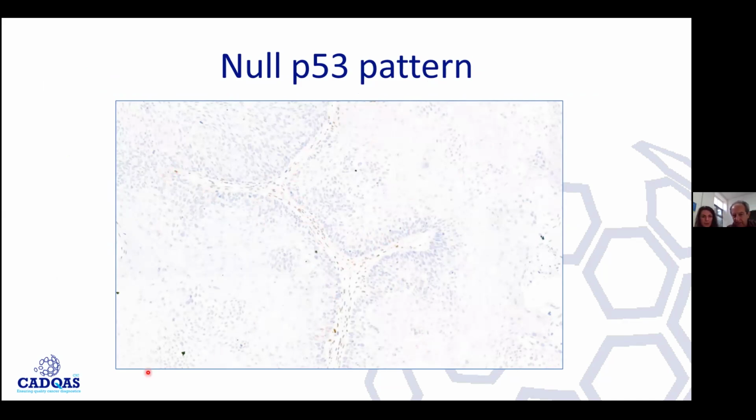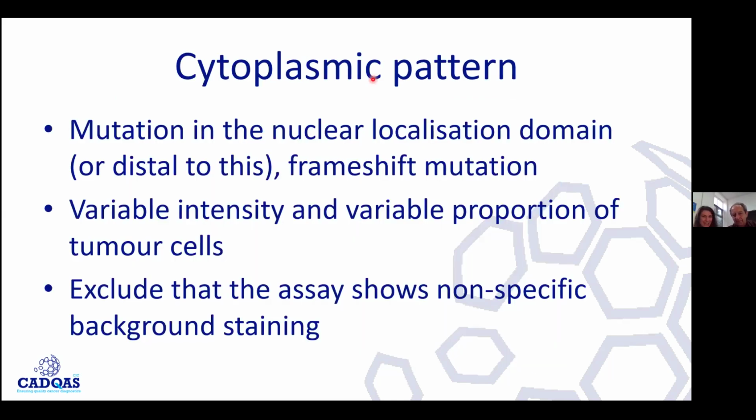I think there's some dirt here, I apologize. And it's interesting how every tumor cell does the same, the uniformity. This seems to be often not a mutation in little areas, although I'm pretty sure you will show us some examples where there could have been an area with complete loss, and then the rest of it wild type pattern, and then good luck in recognizing that.